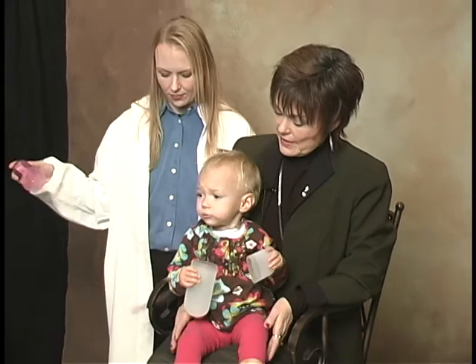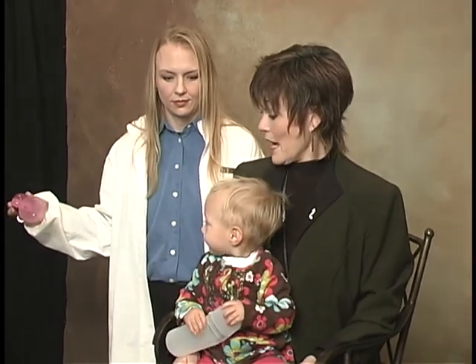Hold it 36 inches out. That was very loud, but she located the sound directly on the point of where the sound is coming from.